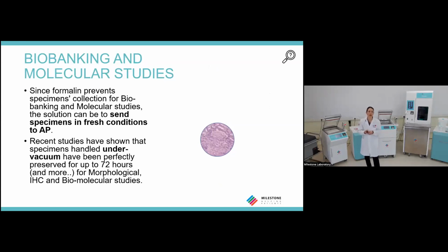It's for this reason that many hospitals started many years ago to use the vacuum technology, because there are now many studies that prove that a tissue sealed with the correct level of vacuum and positioned at 4 degrees, the quality for immuno and molecular studies is preserved up to 72 hours. Why did the authors study the 72 hours? Because this is the weekend, so this is what the hospital needs.